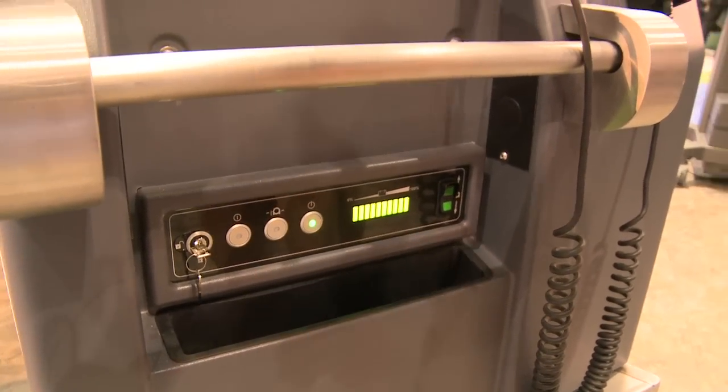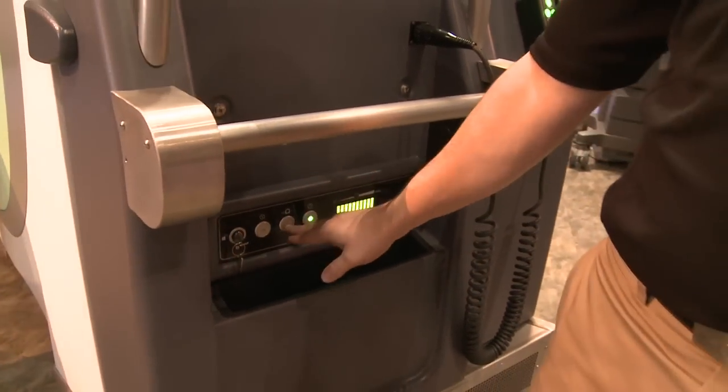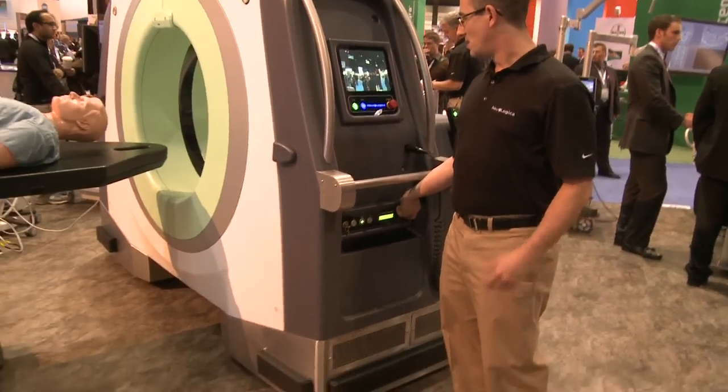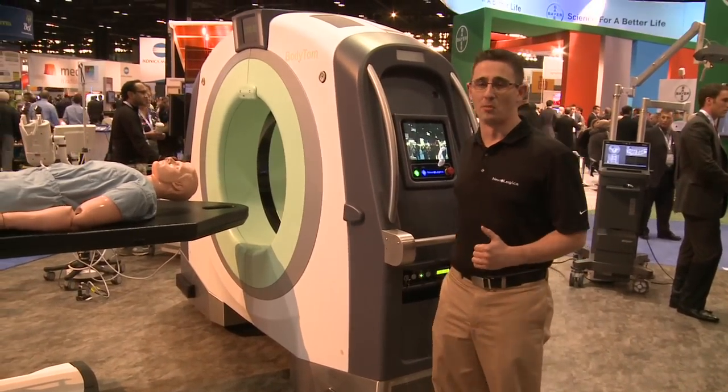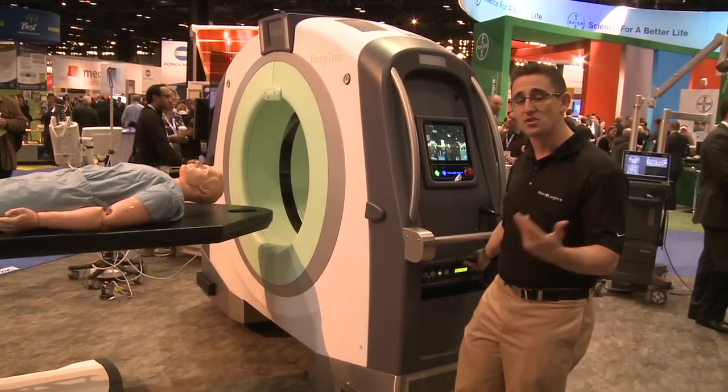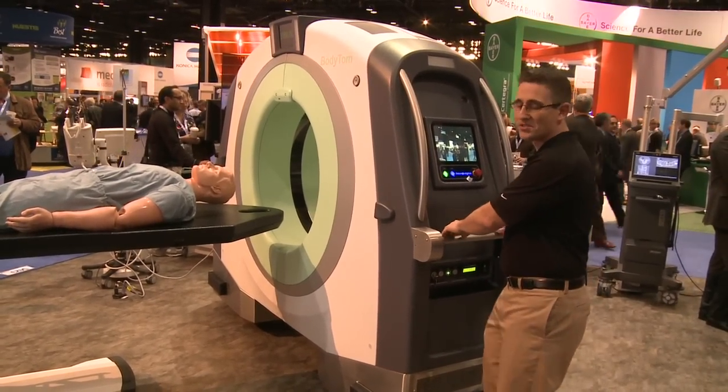When you're ready to move BodyTom throughout your hospital facility, it's easy. Put it in transport mode. What you hear now is BodyTom going into transport mode. We're dropping four casters down onto the ground — two drive casters and two steering casters — and it drives as easy as possible.